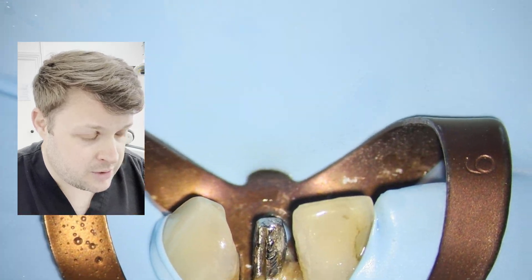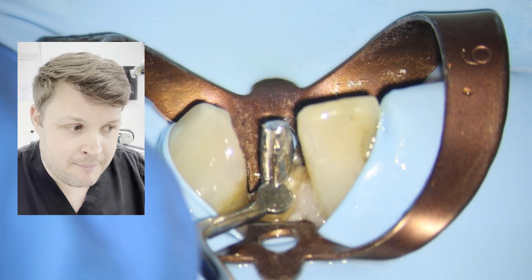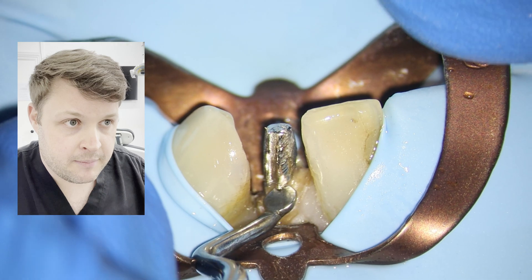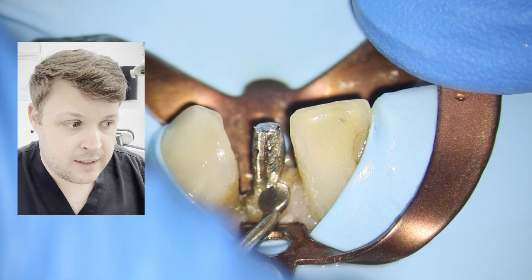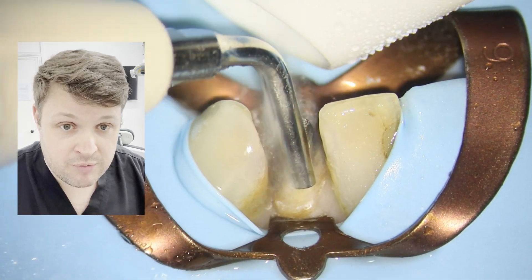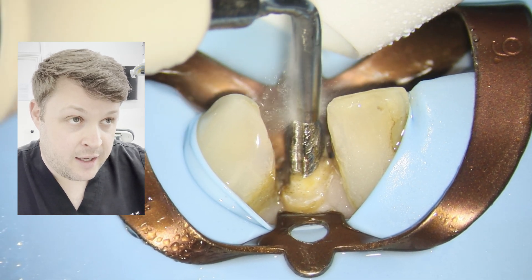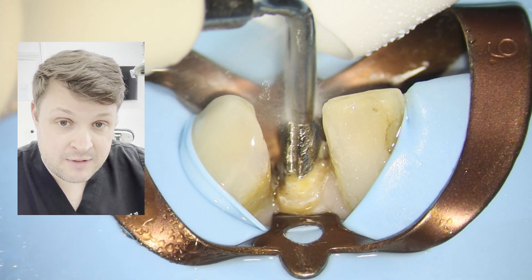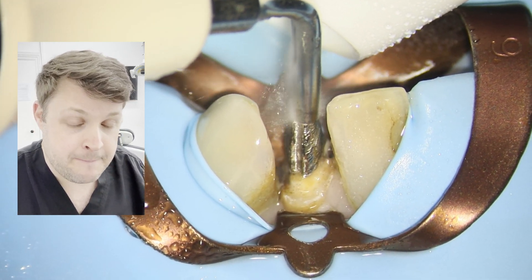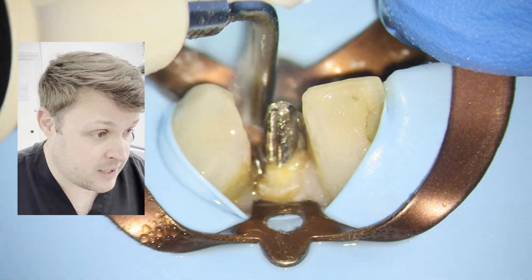I'm trying to undermine it as well, because if you've got a little bit of movement it might just go. This is probably more significant with straight-sided posts rather than serrated posts. There's more movement now, and notice I'm using that concave aspect of the tip on top of the post — that vibrates right down the middle of the post. I use that quite a lot and it can work really well in some cases.